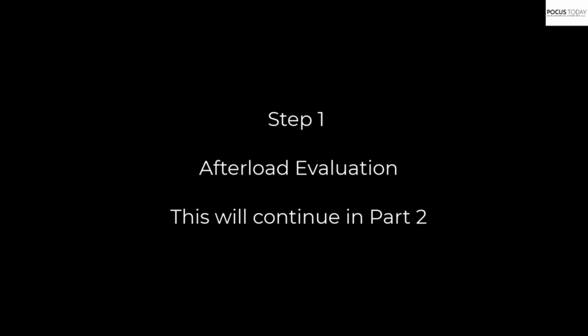We will continue with afterload evaluation in part 2 of this series. To summarize, we have looked at the 5 POCUS cardiac views for evaluation of contractility of the RV and LV in this tutorial.